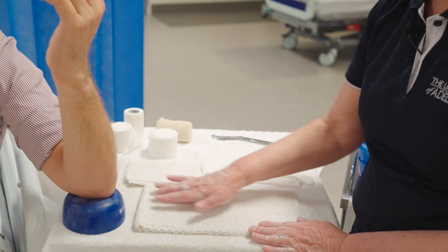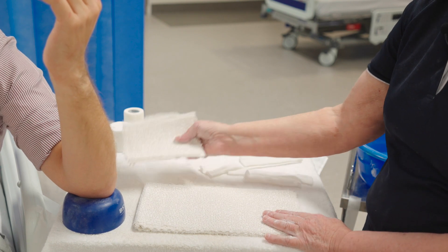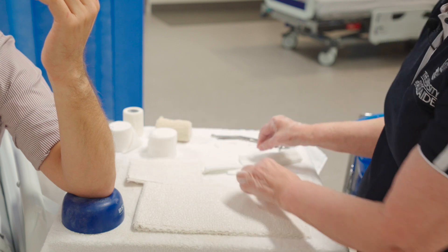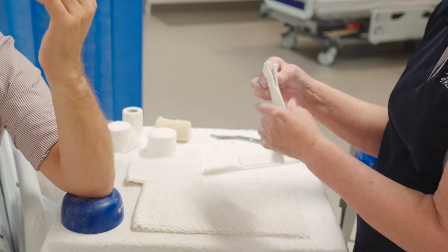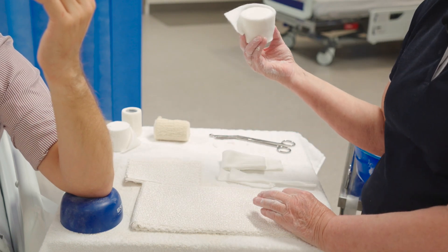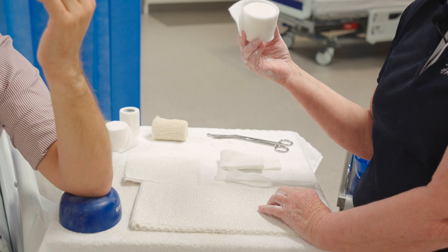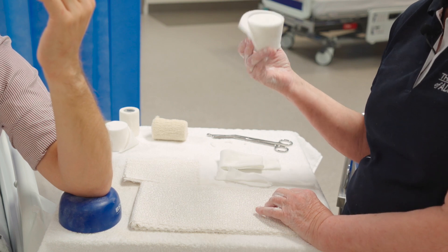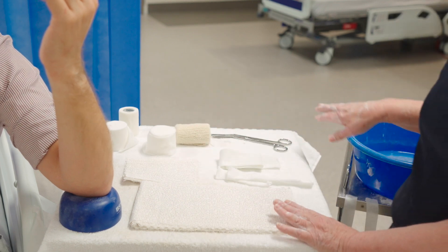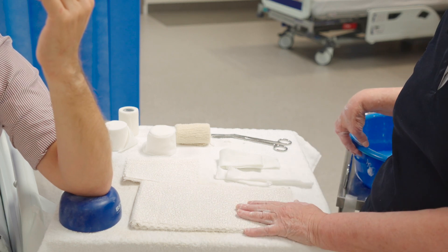The materials you'll need are a gypsonal slab of 10 layers — that's our standard guideline for casting. You'll also need another piece of slabbing material about five layers thick, which will go along the hand. You need two pieces of size one stockinette to go over each finger, and a size two to go over the arm. We also have soft band for padding — be aware of bony prominences and make sure they're well padded. Apply with tension that is not too tight and not too loose. Have a bandage ready and cool room-temperature water, so the exothermic reaction between the plaster and water doesn't burn the patient.